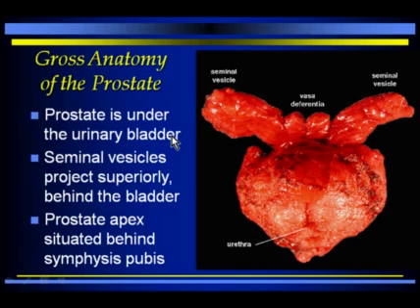Okay, so we've finished our rapid discussion through the scrotum now. We've discussed testicular masses and extratesticular masses. We've discussed the acute scrotum. We've talked about the distinction between epididymitis and epididymal orchitis on the one hand and testicular torsion on the other hand. These are very important topics, and these are the two most important reasons you'll be asked to look at the scrotum: evaluation of tumor and evaluation of the acute scrotum.